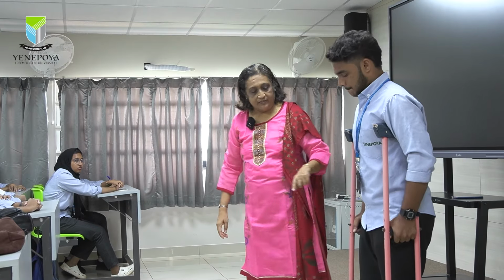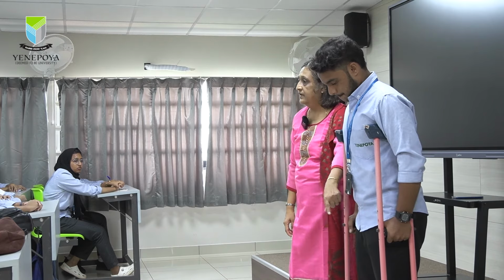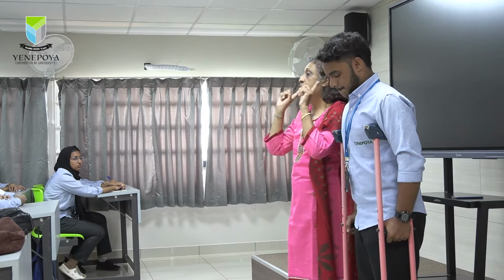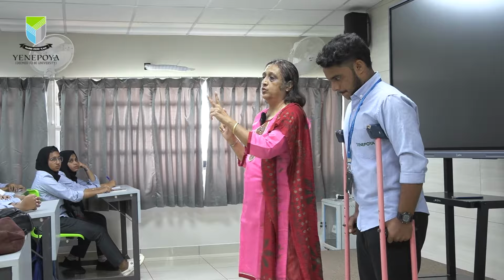In the 2-point gait, the crutch on this side, the right side, and the leg on the other side go forward together, and that becomes 1 point, whereas the opposite leg and the opposite crutch go together in front, and that becomes the 2nd point. That means the crutch and one leg go together as 1 point.